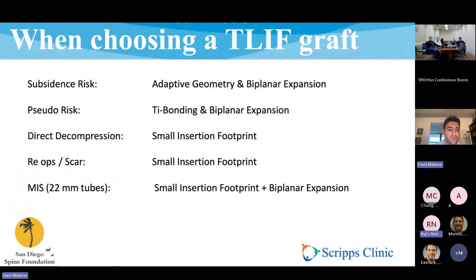So we talked about subsidence risk. We talked about pseudo risk. I think it's important that you're not using PEEK cages. You've got to have some kind of more hydrophilic surface technology.